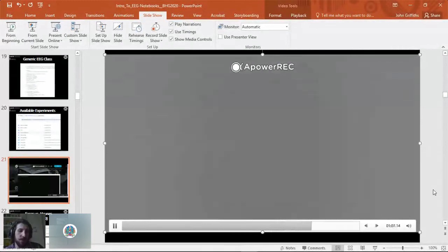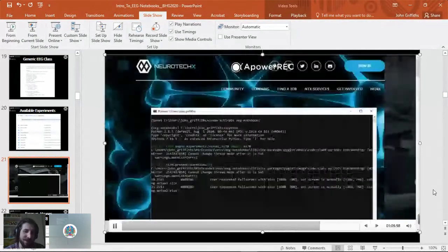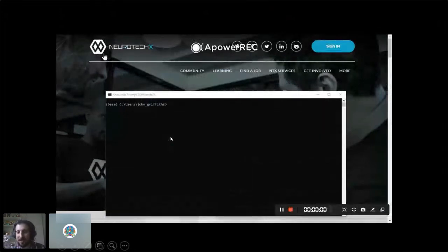Now, people who have a psychology or cognitive neuroscience background will know that faces versus houses is a big thing in cognitive neuroscience, especially in fMRI actually, but also in EEG and MEG. The reason it's interesting is to do with expertise. It's to do with specialization in the visual system.